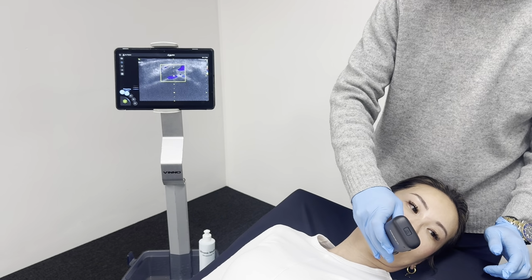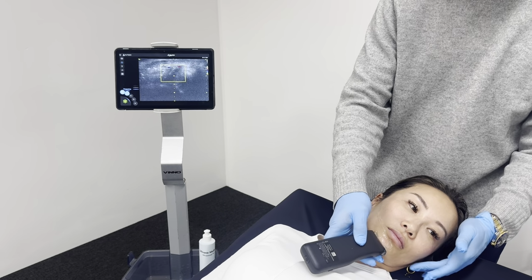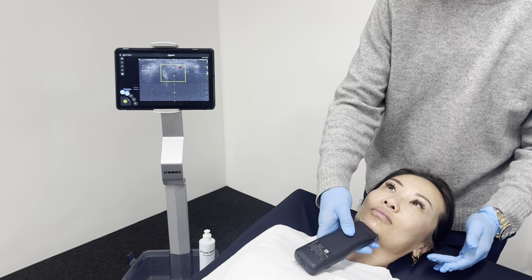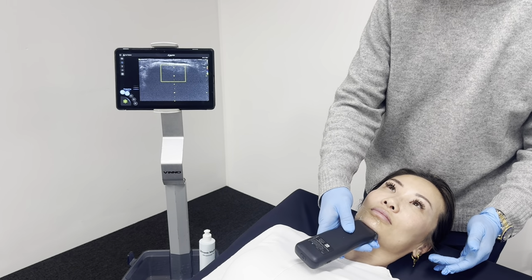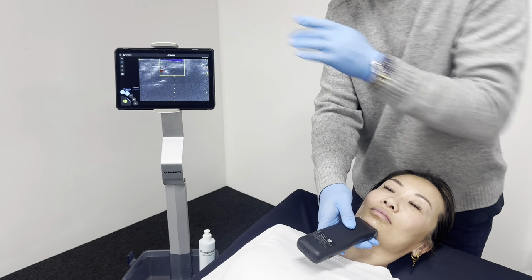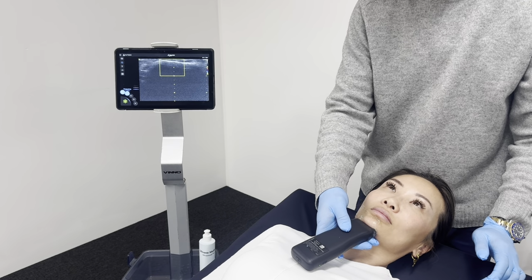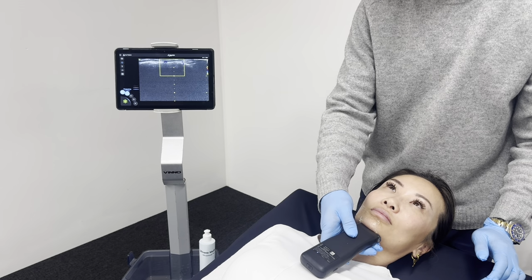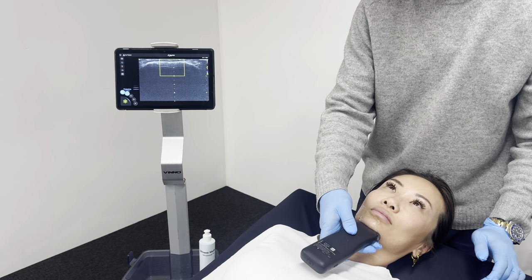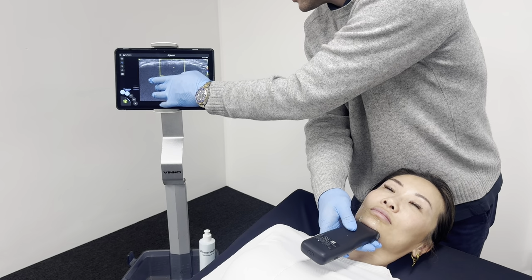So if I put the probe on here and I'm looking for colour flow, usually I have to go underneath the chin. Can you just lift your chin up just a second there? I'll see if we can see any of that colour. Let's bring the box right to the top of the screen. And sometimes you really have to tilt and rock the transducer like I'm doing now to put it at a bit more of an angle. I can only just see a little bit of that vessel on that side there.